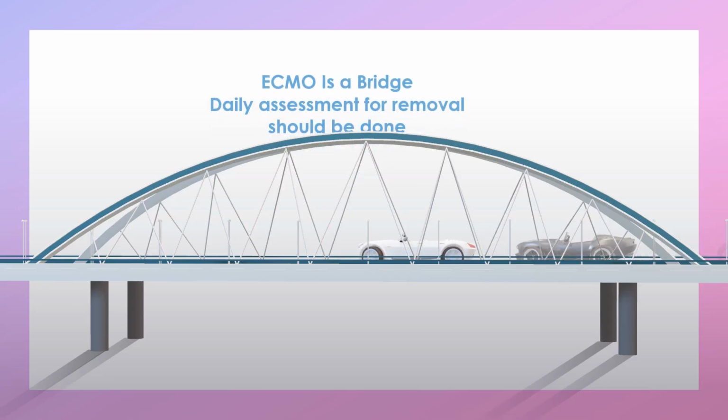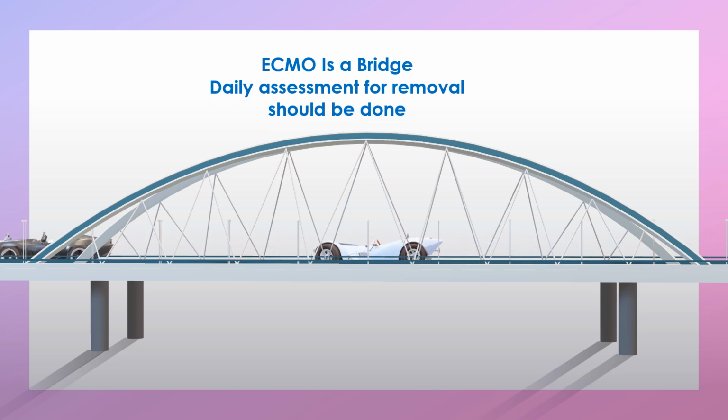This will be the second part of weaning from venoarterial ECMO. As we mentioned before, ECMO is a bridge therapy, it's not a destination therapy. Daily assessment for removal should be done.